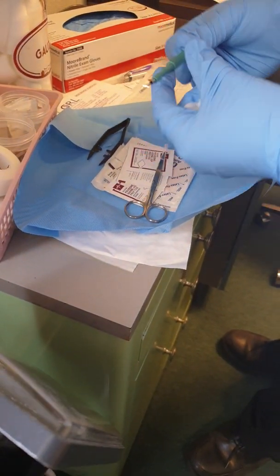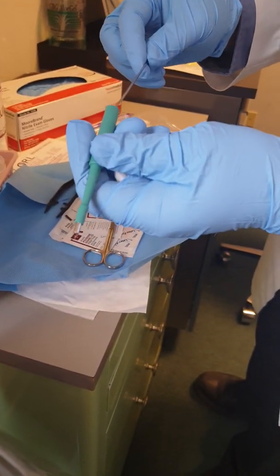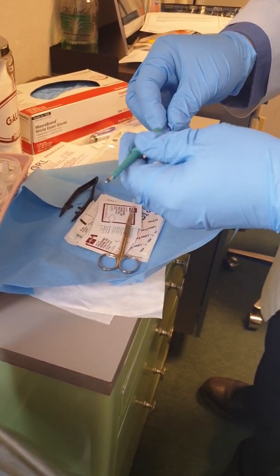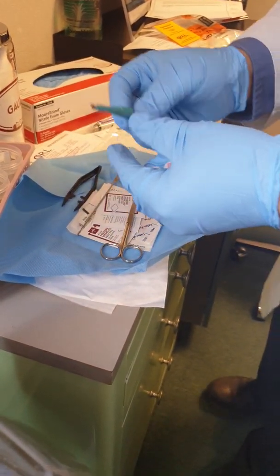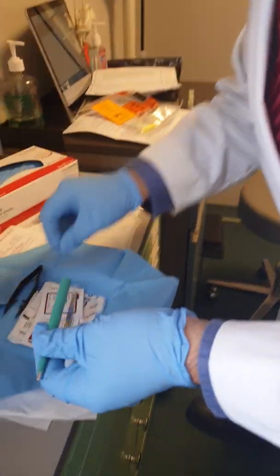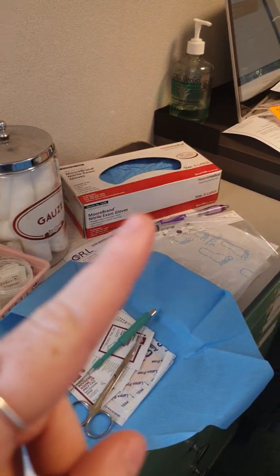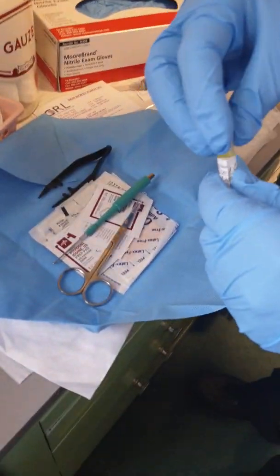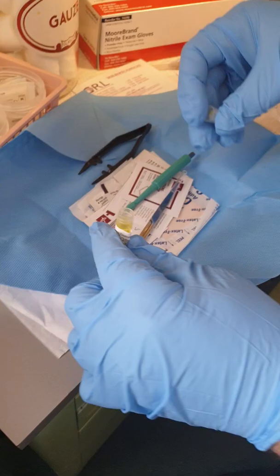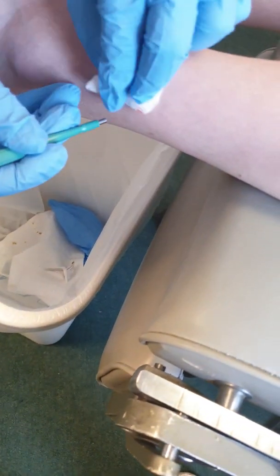This thing has a punch biopsy — three millimeters wide — and it has a poker in there so we can drop the specimen into the vial. We prepare our vials first; the vials are prepared. We open that up, get it ready right here.